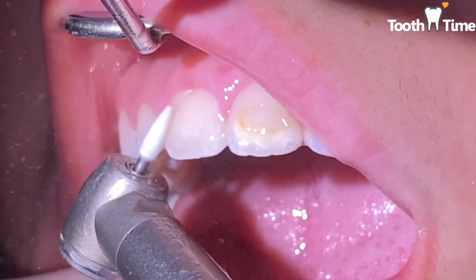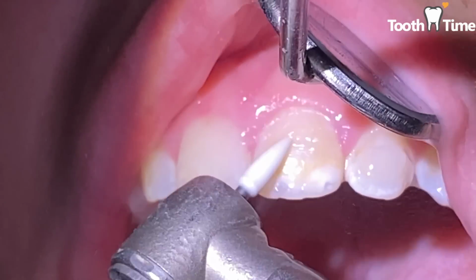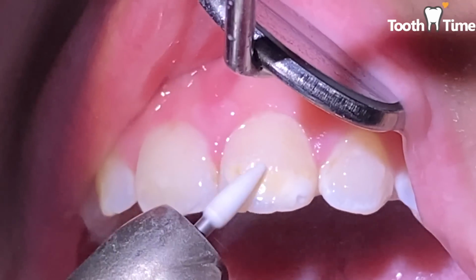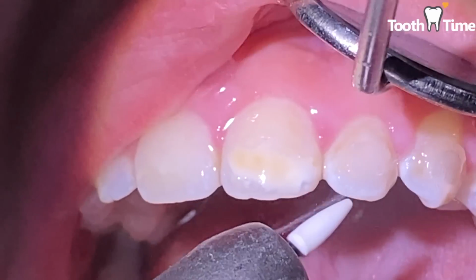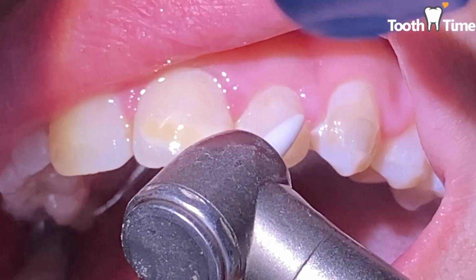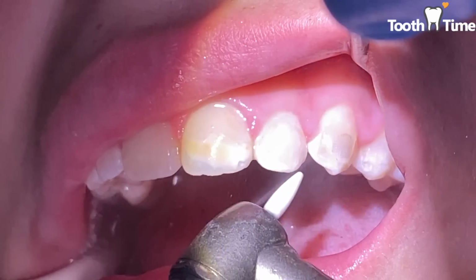So like I said, I went ahead and I removed some of the plaque residue on her teeth. Now, sometimes it can be uncomfortable for patients when we do this, just depending on how much plaque they have and how inflamed their gums are. With our patient, she didn't really have that much inflammation or plaque, but it was still something we had to remove. So just know that anytime that you have any plaque or inflammation in your gums, you do have gingivitis. That means you're lacking somewhere in your oral hygiene regimen. That means you're probably not flossing, not brushing very thoroughly.